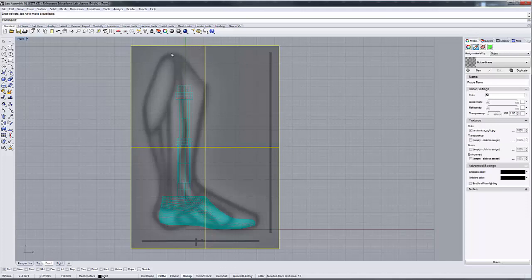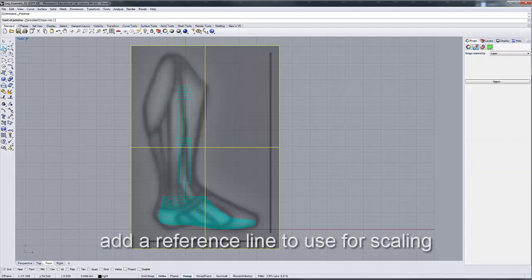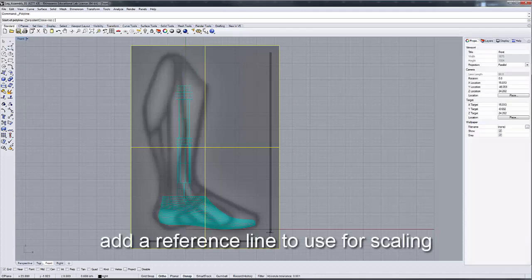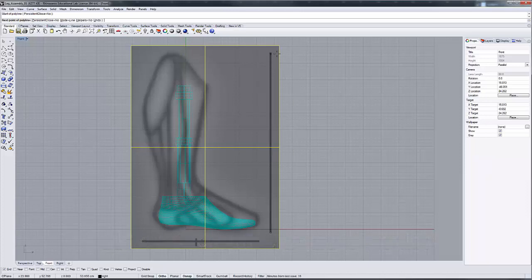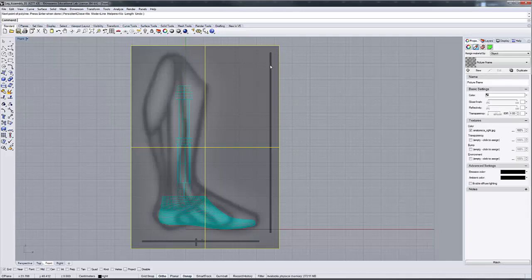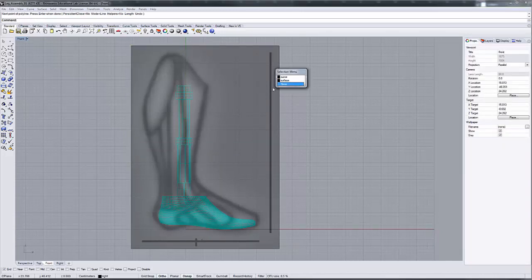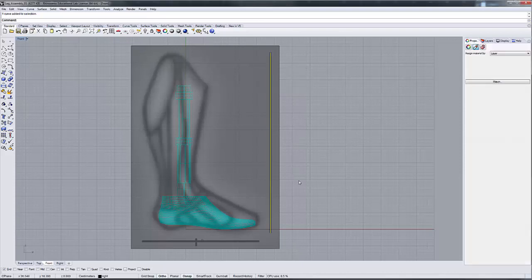Once I've established the scale for my image, the next step is to create a reference line. I'm going to start right here at the bottom of my tick mark, and with my ortho snap turned on, I'm going to make a reference line right there. I'm going to use that line to scale all of the other images that I bring in to this composition, because as long as those lines match up, I know that the scale will be on and proper.